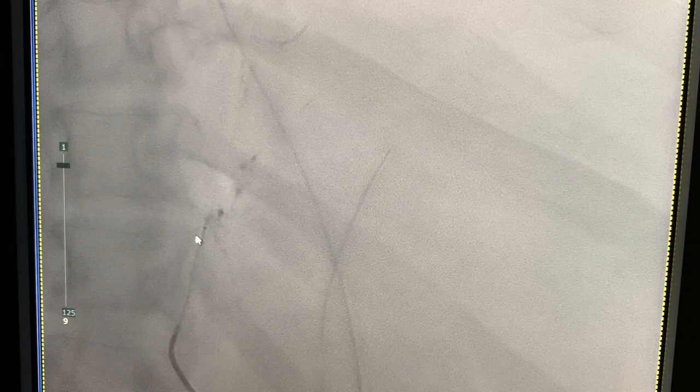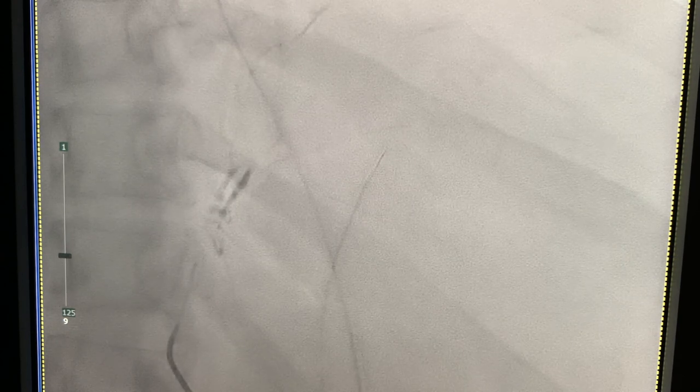This is the embolization run. You can see that my microcatheter is still in the left gastric artery and you can see the glue particles moving forward. I decided to embolize with glue because the patient is coagulopathic due to his liver disease, and embolic glue does not depend on the coagulation cascade to work like coils and other embolics do. The glue is mixed with lipiodol to make it radiopaque, and you can see it going towards where it needs to go.